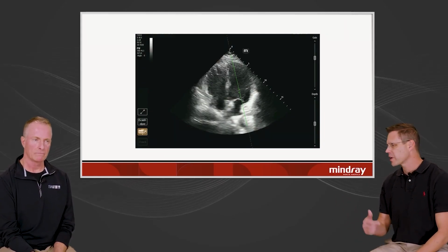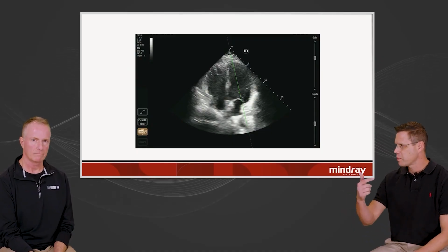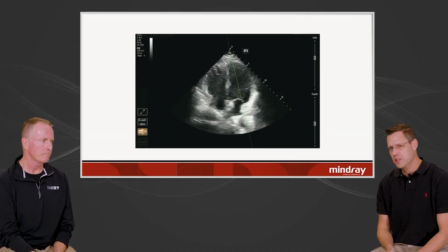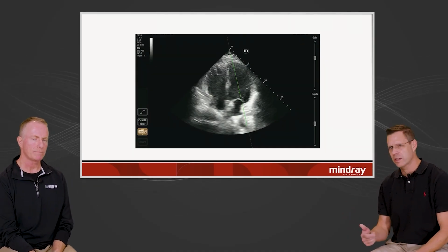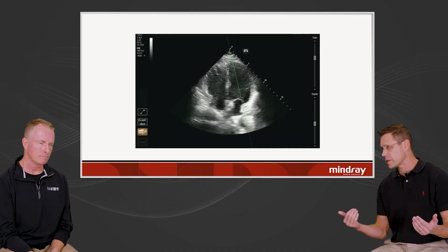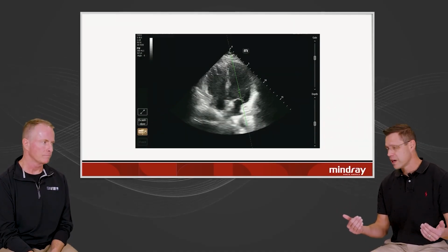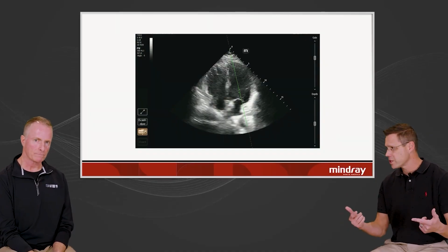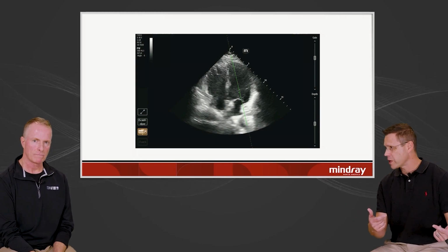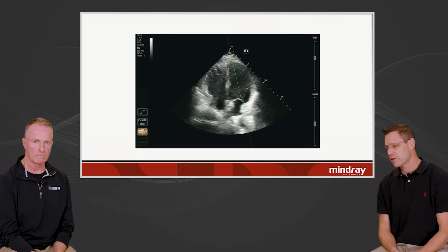But then you have to get into tissue Doppler, and depending upon which machine you're using, you have to take TDI, PW, then sometimes you have to go back to TDI. But in the AI toolbox with the auto DFR, you simply hit the button. It drops the pulse wave gate generally close to the mitral valve inflow. You might have to adjust your image slightly, and it begins to get the E and the A measurements, and they come up on the screen. After you've saved that, it converts to tissue Doppler imaging. It drops the tissue Doppler gate along the medial mitral annulus, and then it starts to measure your E prime.